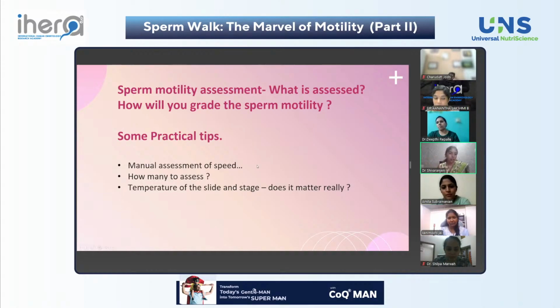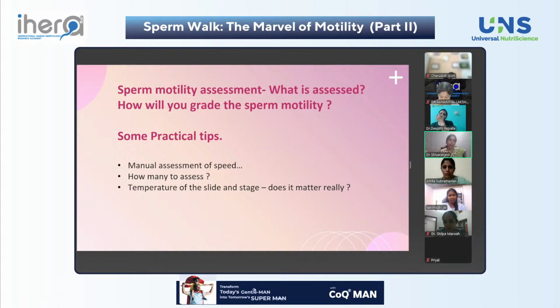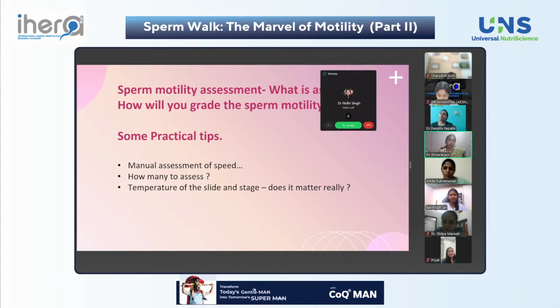So if the second sperm should be checked, and then that sperm, how it is going, moving forward like slowly or in a forward motion, and then click B if at all it is slow. So it should be like that. So as Anant Lakshmi ma'am told, it is like 200 to 400 we have to count and then take an average. So rapid progressive, all percentages.